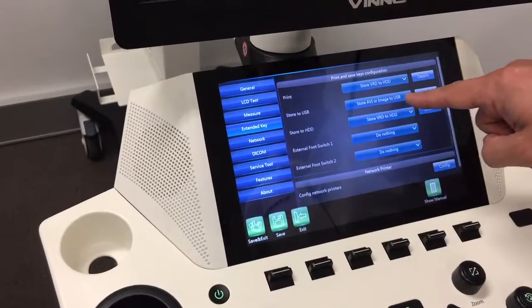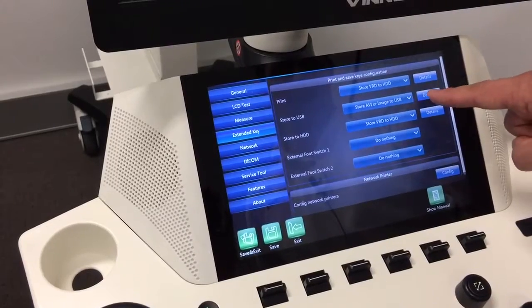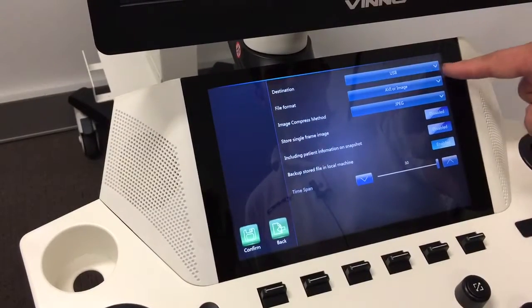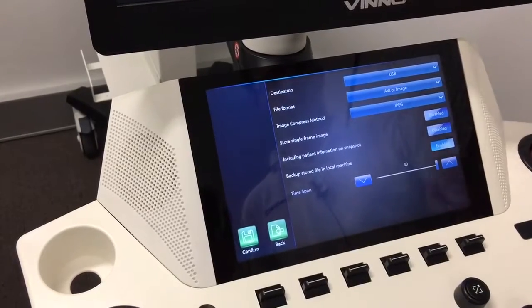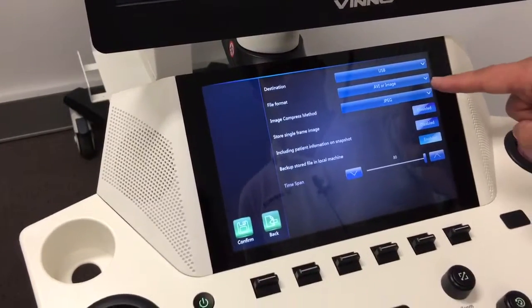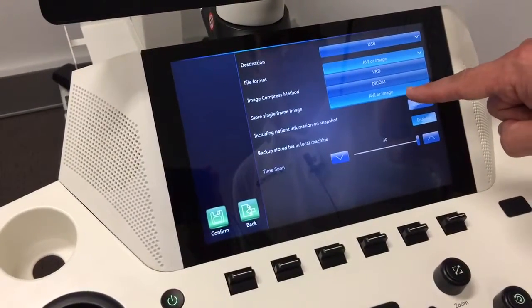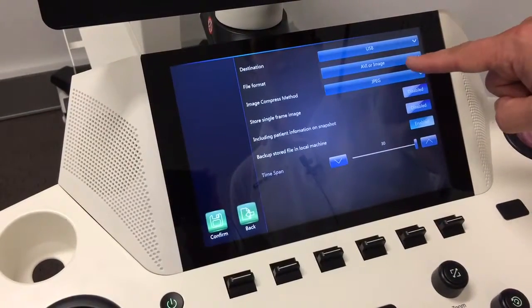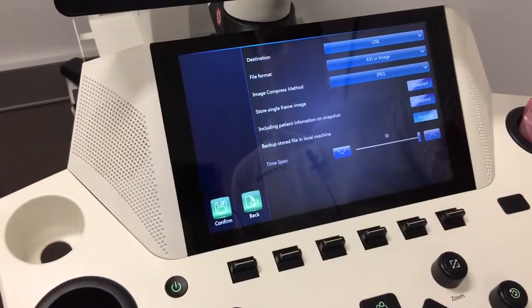For store to USB, you have the exact same options: print, store, etc. For this setting, I'd recommend saving it to the USB. For a USB, if you're going to be playing it on a computer and not transferring it to another Vino machine, I'd always recommend having either AVI or image set, because it's going to be the only option that lets you take it and put it in a computer and play it back at a later time.